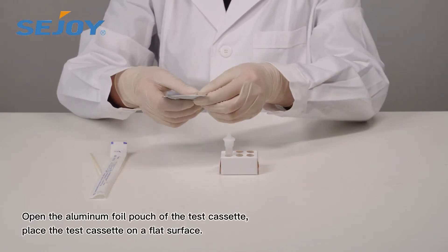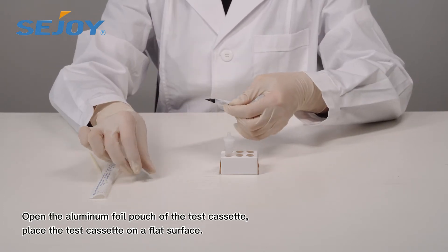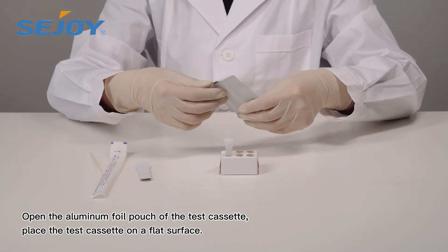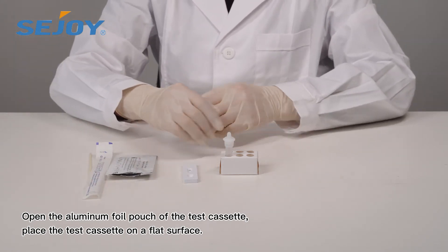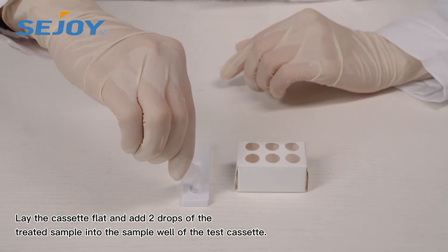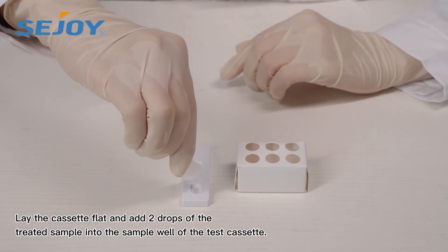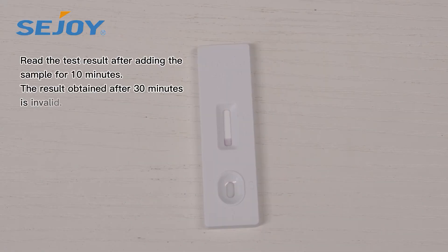Open the aluminum foil pouch of the test cassette and place the test cassette on a flat surface. Lay the cassette flat and add two drops of the treated sample into the sample well. Read the test result after adding the sample for 10 minutes. The result obtained after 30 minutes is invalid.